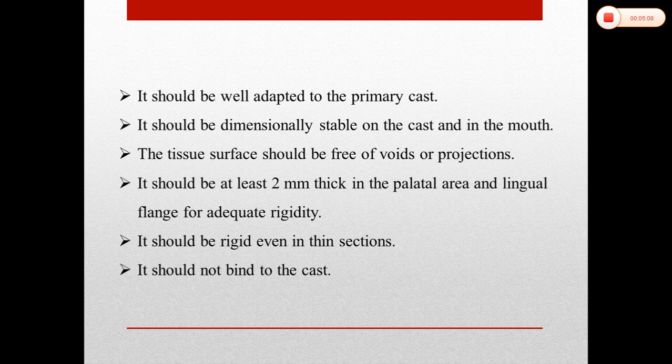That's because we have different types of areas in the oral cavity, in the maxilla or mandible, where we have some stress bearing areas, some relief areas, some support areas. We always have to see that the maximum amount of stress is received by the support areas and the stress bearing areas.